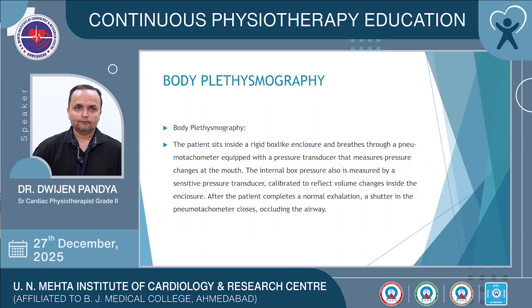There is another test, which is body plethysmography. In body plethysmography, the patient sits inside a rigid box-like enclosure and breathes through a pneumotachometer equipped with a pressure transducer that measures pressure changes at the mouth. The internal box pressure is also measured by a sensitive pressure transducer calibrated to reflect volume changes inside the enclosure.